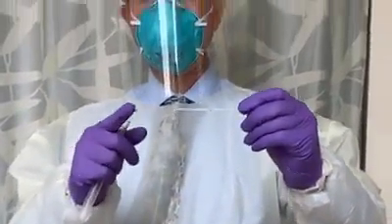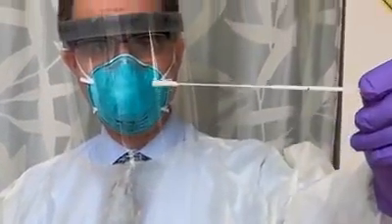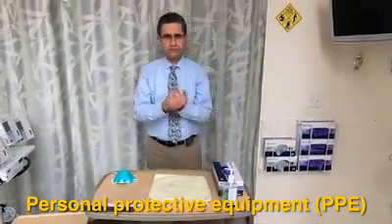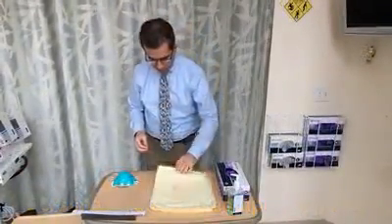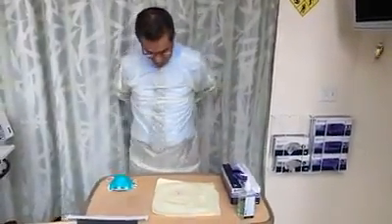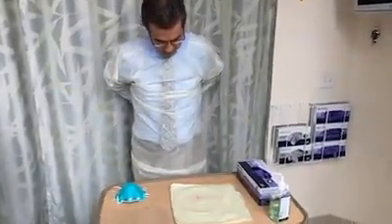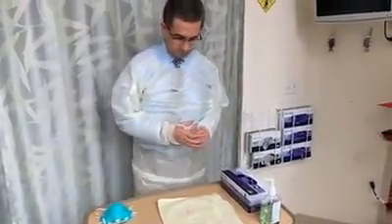Nasopharyngeal swabs are specifically manufactured to have long, flexible shafts made of plastic or metal and tips made of Dacron, rayon, or flocked nylon. It is essential to put on personal protective equipment, or PPE, correctly, and to follow the pertinent respiratory and contact precautions according to both the Centers for Disease Control and Prevention, or CDC, and your institution. If possible, you should put on and take off PPE in the presence of an observer to make sure that there are no breaks in technique that may pose a risk of contamination.